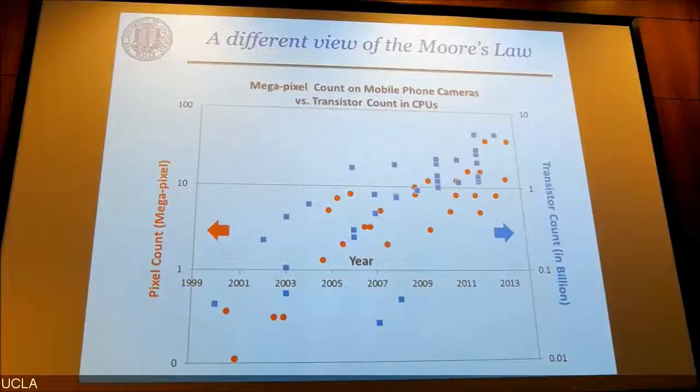They were essentially funded, but since then we don't have any funding specifically on HIV, so it's not something that's continuing. However, some of our readers are being used. Celmic's readers, the company's readers, are being used in Africa for diagnostic purposes, for reading lateral flow tests. But they're not using lensless technology. They're using an imaging-based, lens-based sensor that's integrated with a mobile phone for quantification of lateral flow tests. So that technology is deployed, and it's a product that's also being used in Africa.